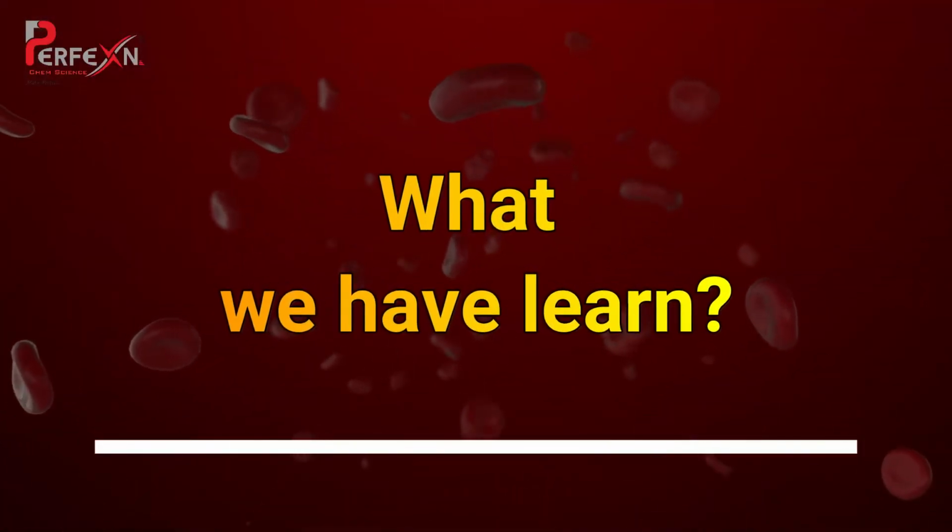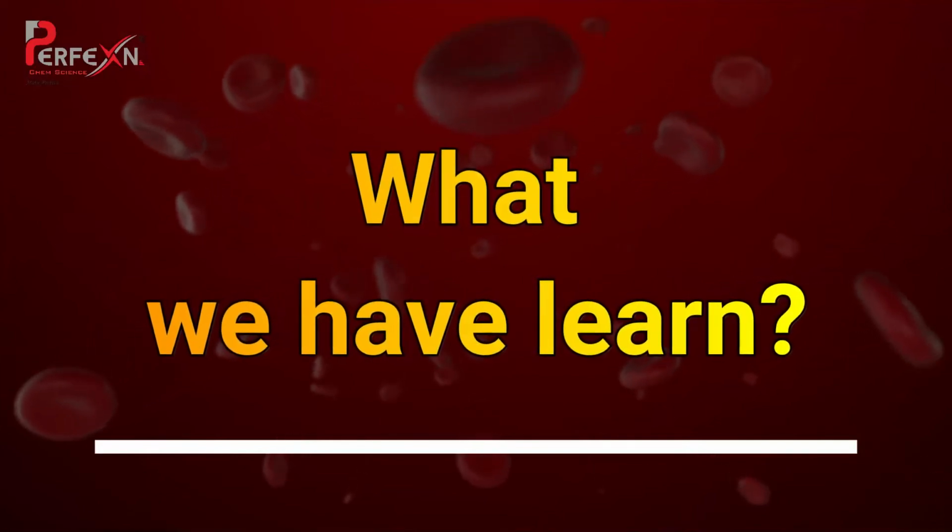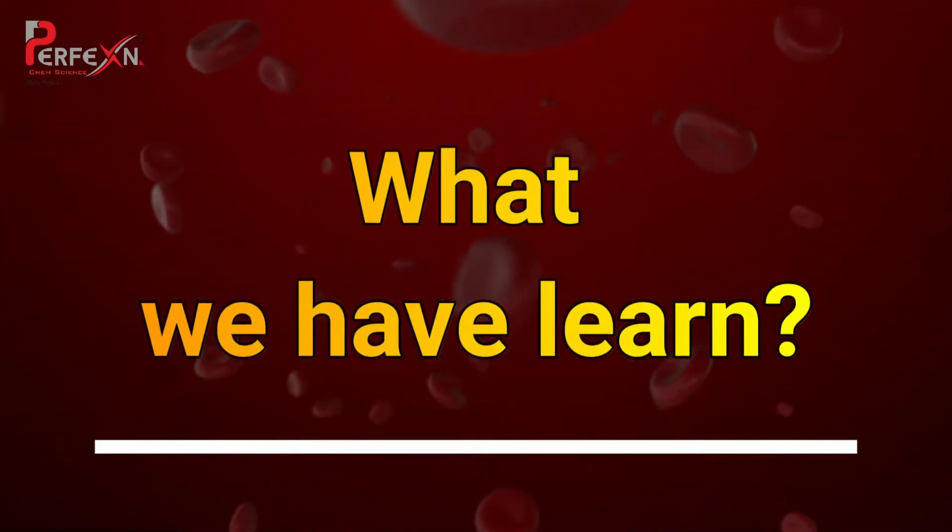So here we have learned about the phosphorus test, its clinical significance, symptoms, kit setting in the semi-bioanalyzer, and procedure for the phosphorus, etc.